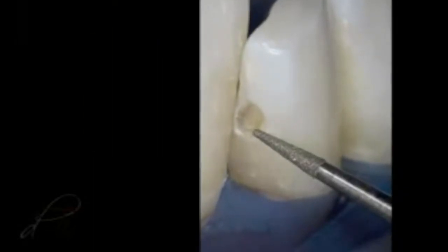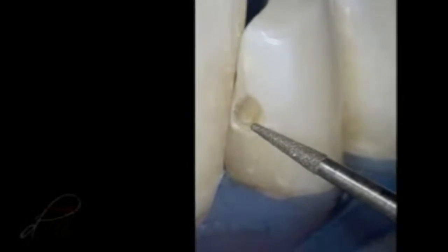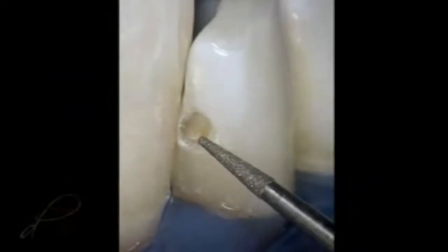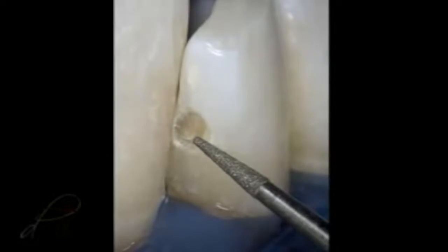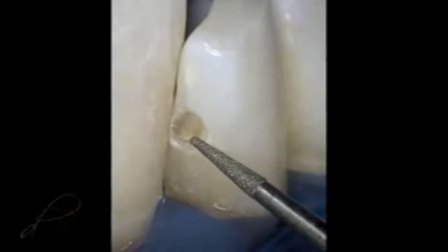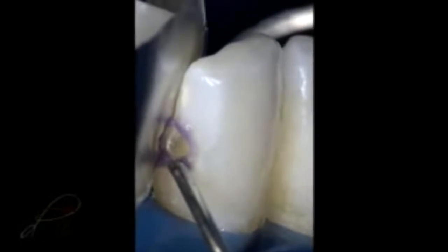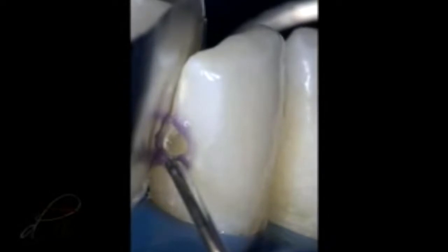An enamel bevel is indicated because it increases the surface area for end-on etching of the enamel rods for an increased etch surface, which results in a stronger enamel to resin bond, which increases the retention of the restoration and reduces marginal leakage and discoloration. The preparation was cleaned with a 2% chlorhexidine solution, Concepsis by Ultradent, rinsed and lightly air-dried.